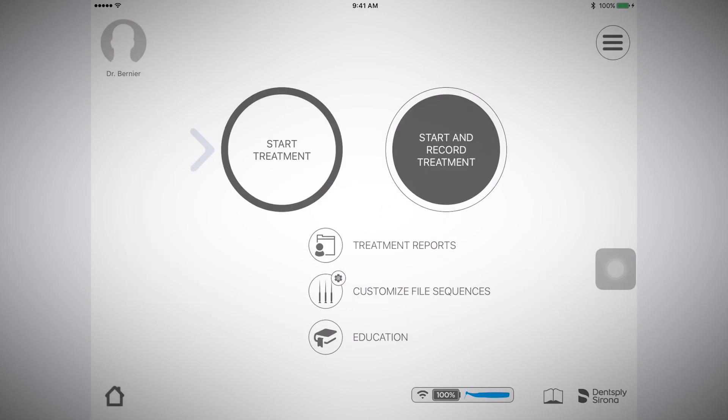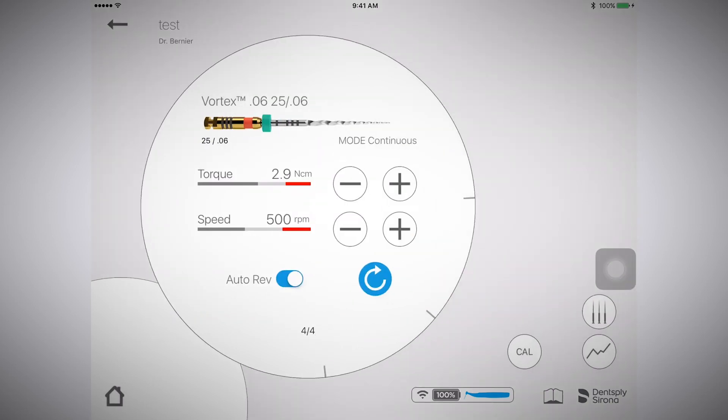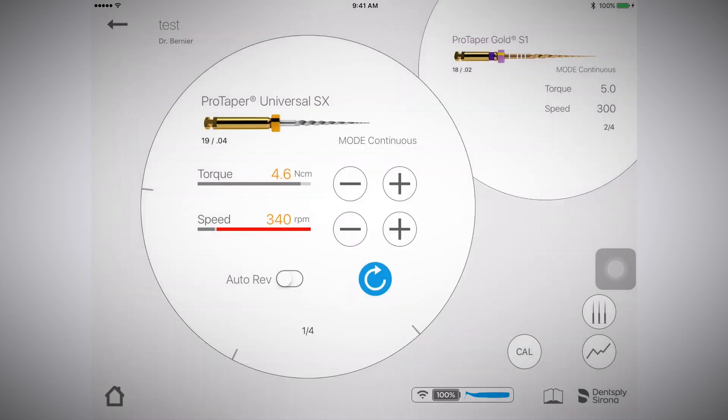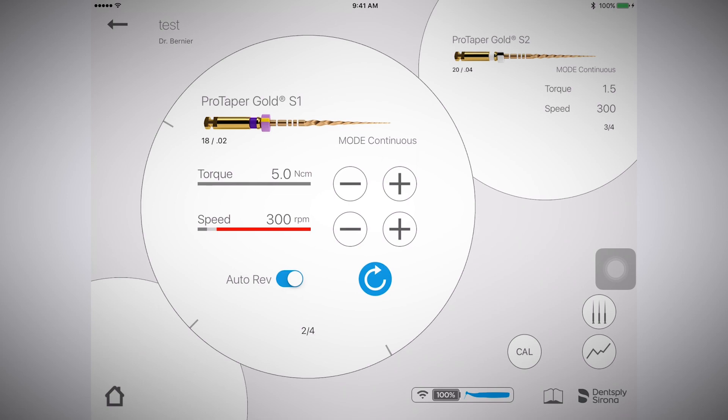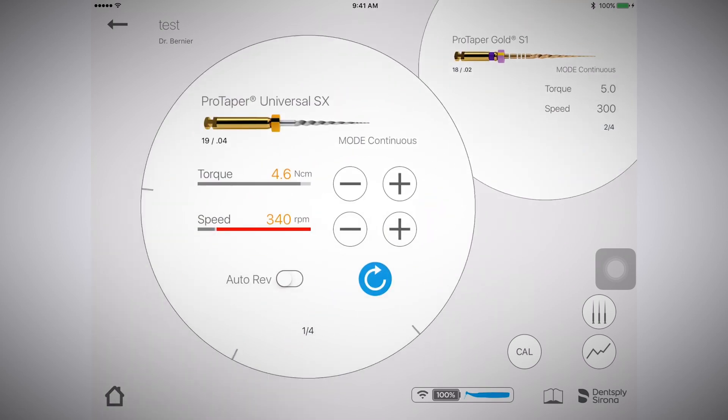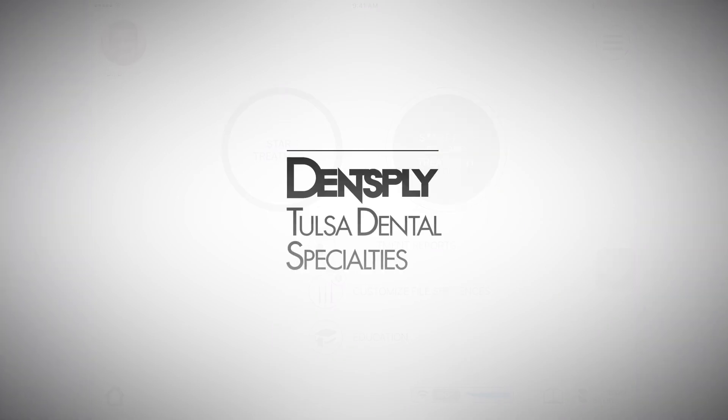The start treatment option on the homepage is the same as the start and record treatment option. However, with start treatment, you do not have the ability to record the procedure, create a treatment report, or tie the procedure with a patient ID.